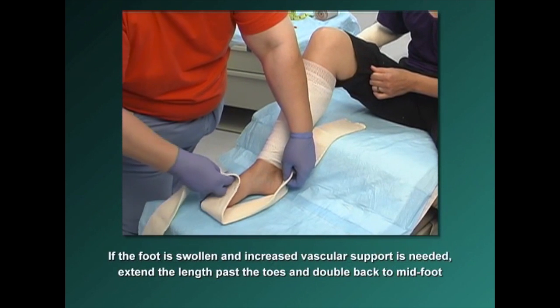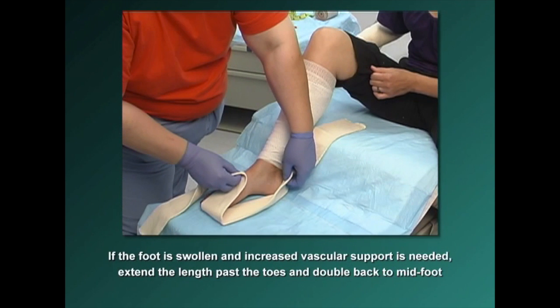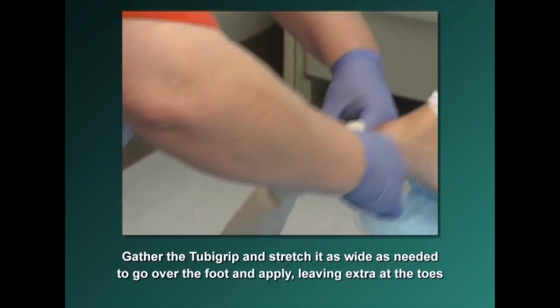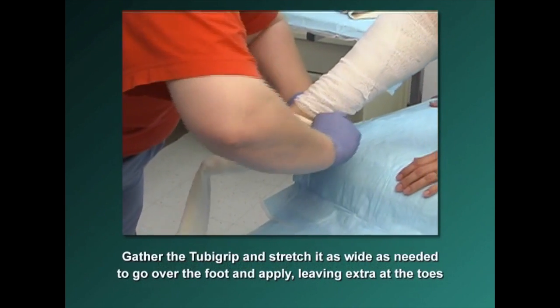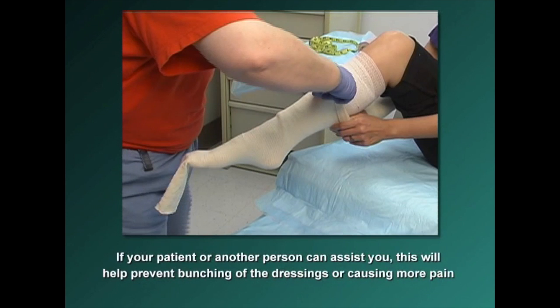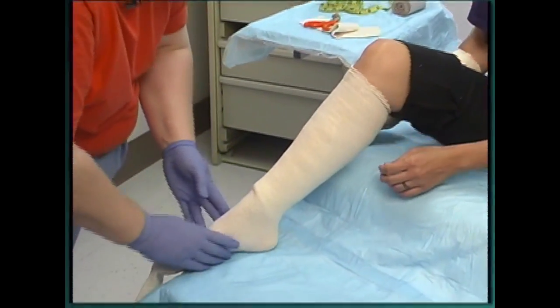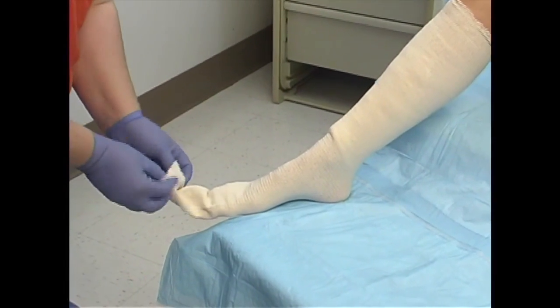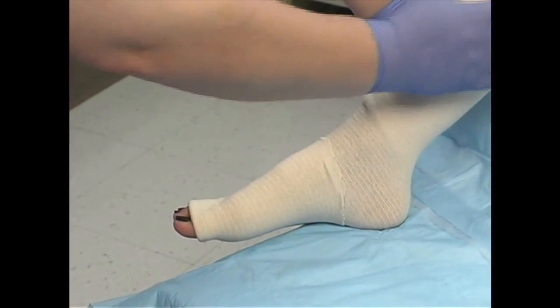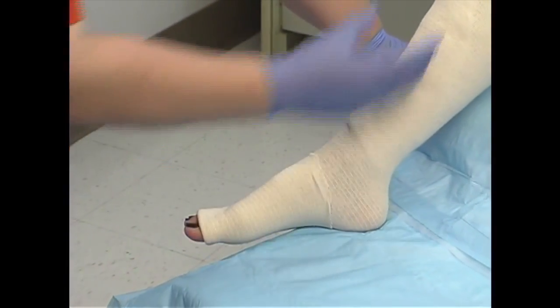If the foot is especially swollen and increased vascular support is needed, extend the length of the Tuba Grip past the toes and double it back to the mid-foot, then cut to this new length. Gather the Tuba Grip in your hands, stretch it as wide as needed to go over the foot, and apply it leaving extra length at the toes. If your patient or another person is able to assist, this will help prevent bunching of the dressings or causing more pain by dragging across the wounds. Even out what's on the foot so there are no wrinkles. Folding it back provides double the pressure on the foot, but since the foot is narrower, you are getting approximately equal pressure to the rest of the leg.